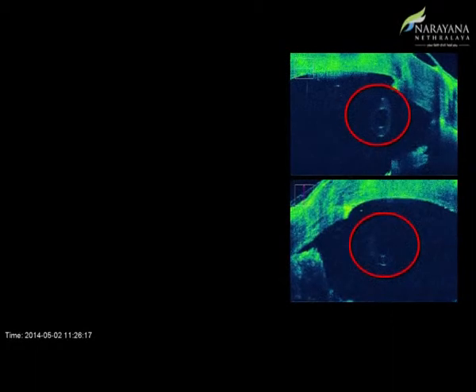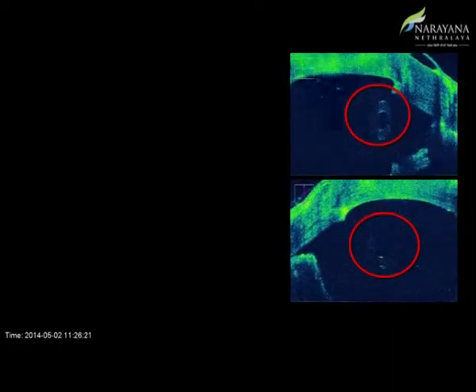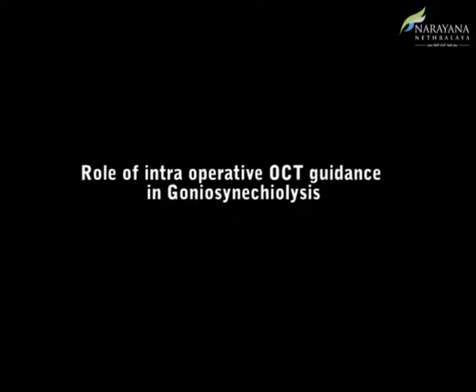A critical step in Ahmed valve surgery is the positioning of the tube into the anterior chamber, which is essentially a blind procedure. OCT guidance could potentially help us obtain a desirable intrascleral passage and entry into the anterior chamber. In this part of the video, we highlight the utility of the IOCT in goniosynechial lysis.